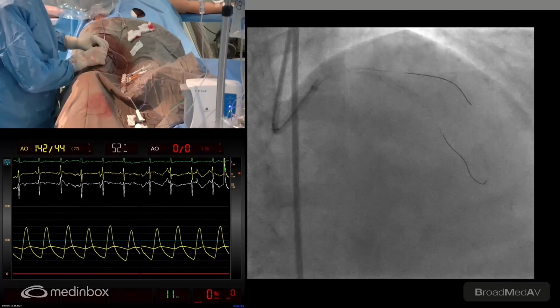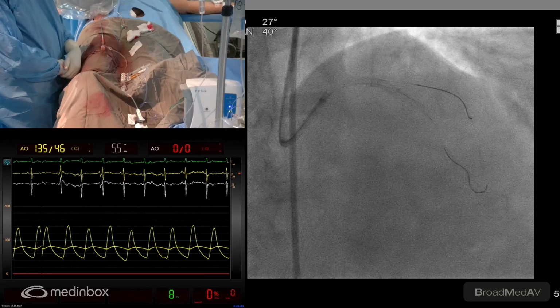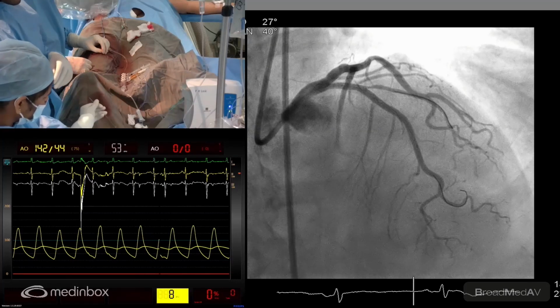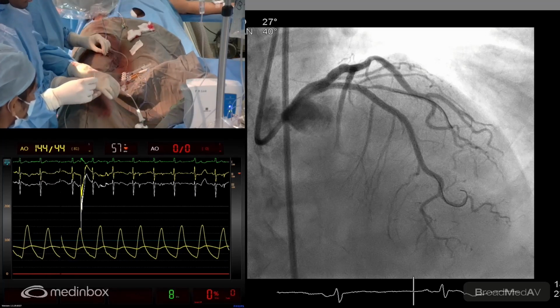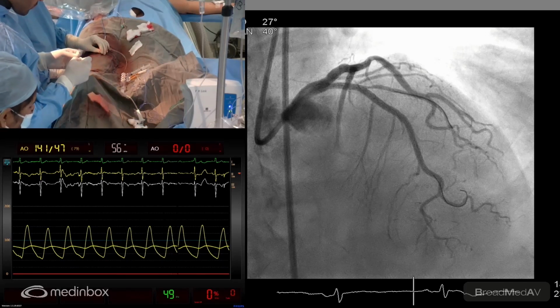I think a nominal pressure with the 3.25 at the distal. So we're taking a 3.25 by 12 non-compliant balloon for post-dilatation. So we shall post-dilate and then take the imaging to see how the MSA has appeared.